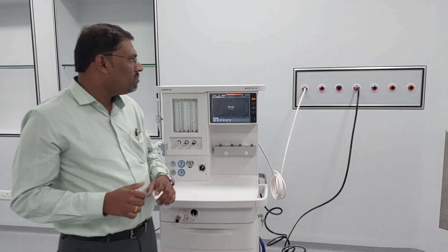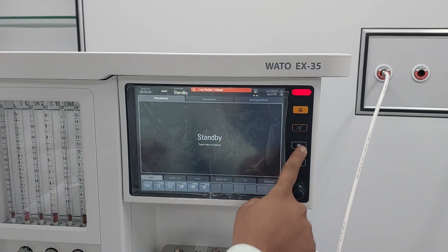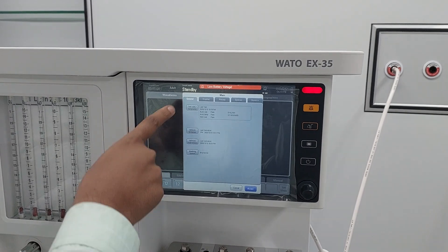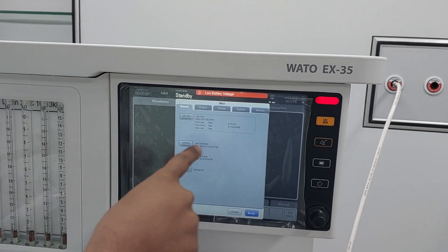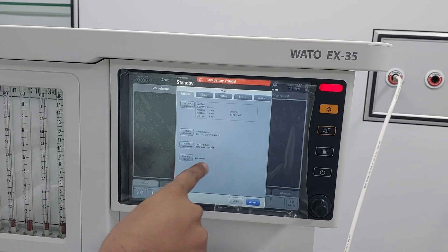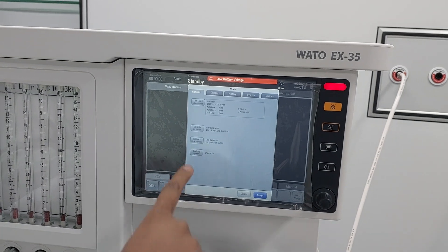But sometimes the machine will not show the proper expiratory tidal volume. At that time, we need to calibrate the flow sensor. This is the machine on standby mode. This is the menu switch — you can observe there are different parameters: leak test, compliance, calibrate O2 sensor, calibrate flow sensor, breathing system.